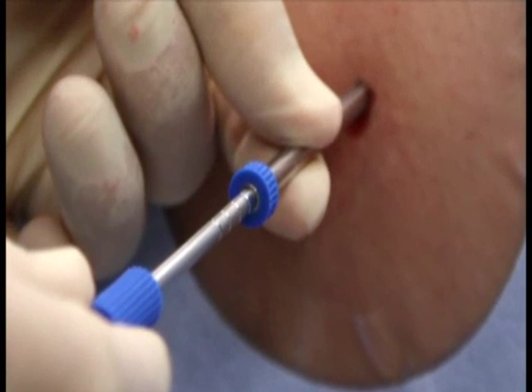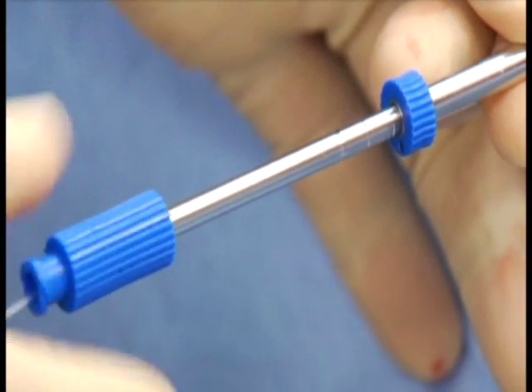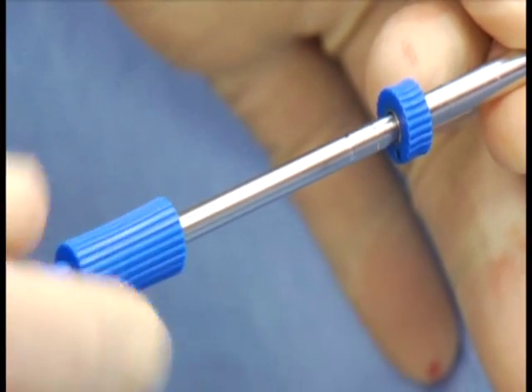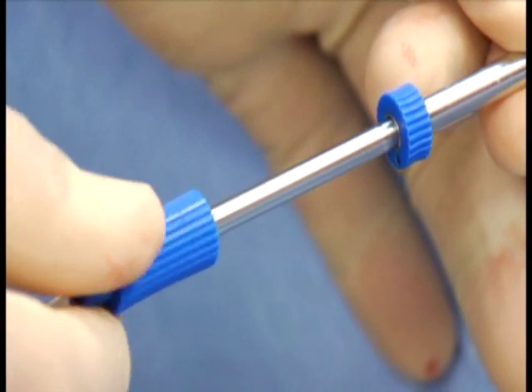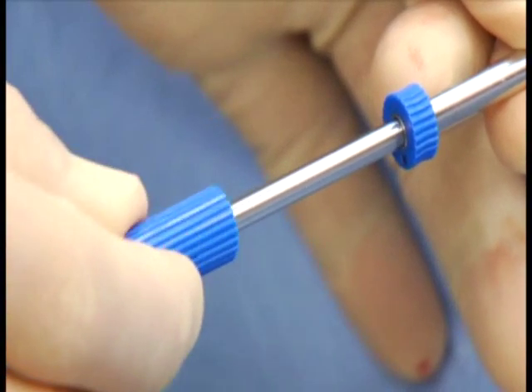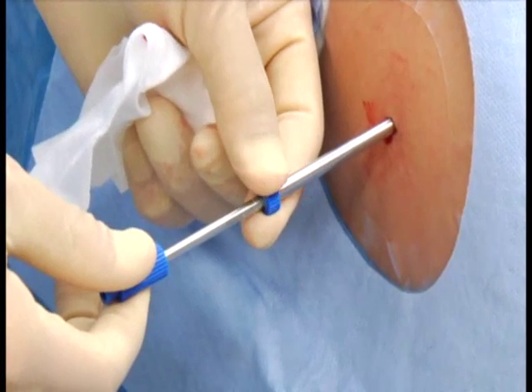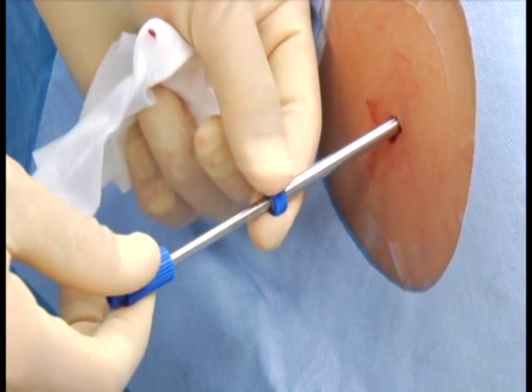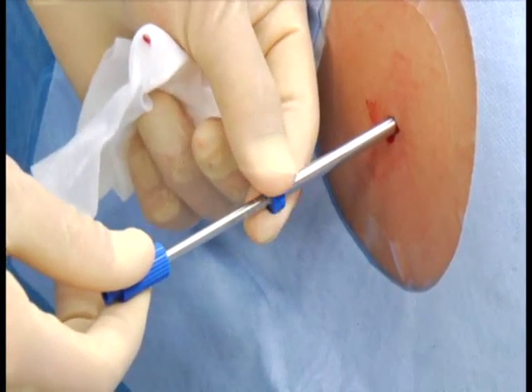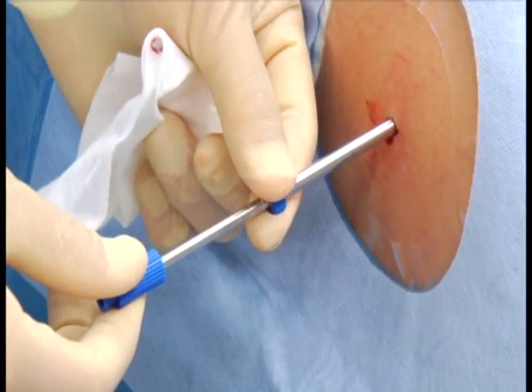With the receiving needle positioned at marker 1 and the cannula held stable, the receiving needle is turned clockwise into the targeted area to a maximal penetration of 20 millimeters. Holding the receiving needle steady, the sample is cut by turning the cannula clockwise over the helix of the receiving needle with a pushing movement until marker 1 is visible again.